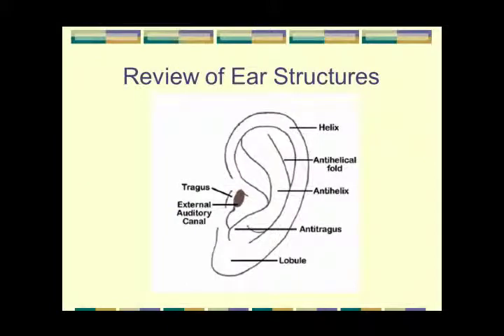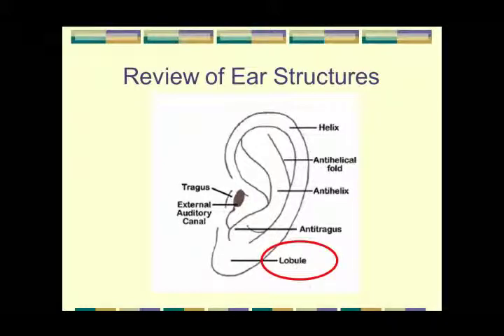And just kind of making sure we understand some of the terms. The tragus is this little portion of your ear, inner portion, right where the auditory canal begins. Lobe of the ear, helix of the ear. Okay, this is some terminology. So we would place, for instance, a pulse oximeter typically on the lobe of the ear. Okay.